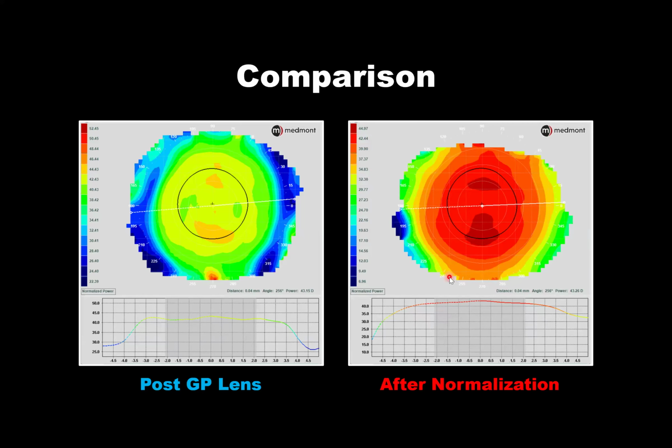¿Y cómo podemos saber esto? No hay otra manera que usar la topografía. Esto es imposible hacerlo con una lámpara de hendidura, por ejemplo.